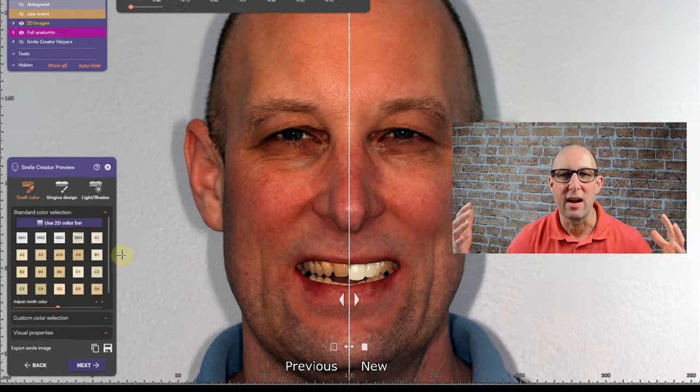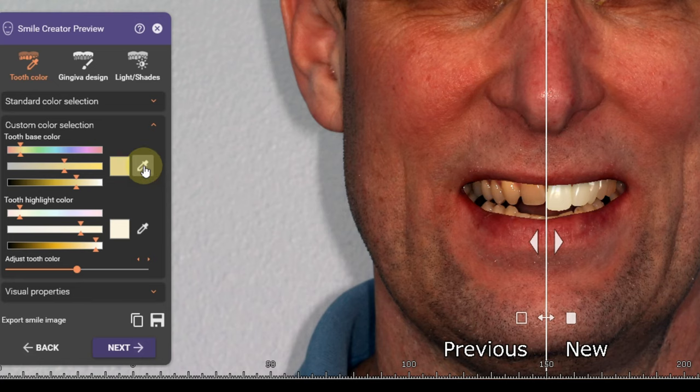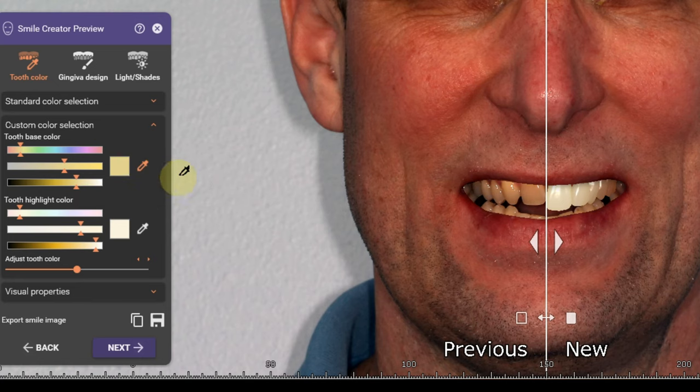Most patients say they want a white, light shade — they want an OM2, they want an OM1. And then when they get the actual teeth, they're going to be super surprised how they look.